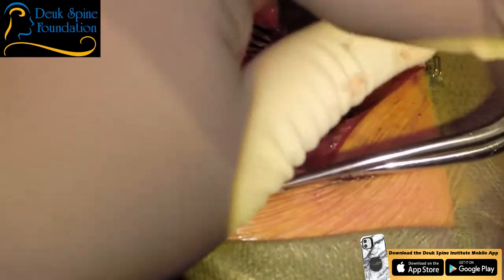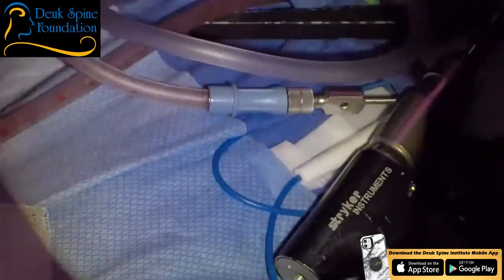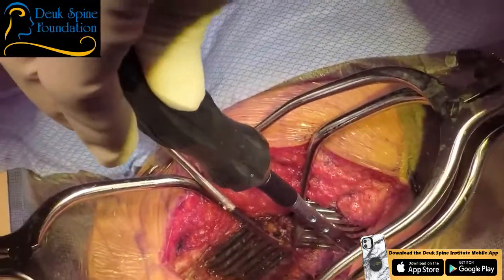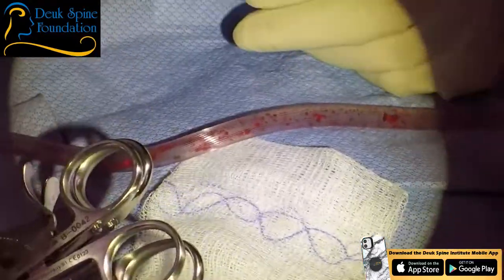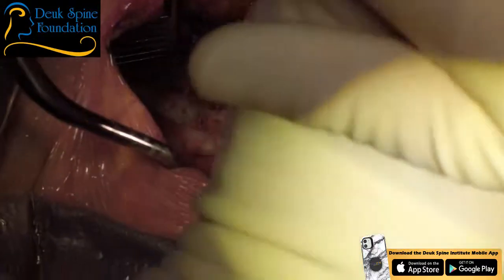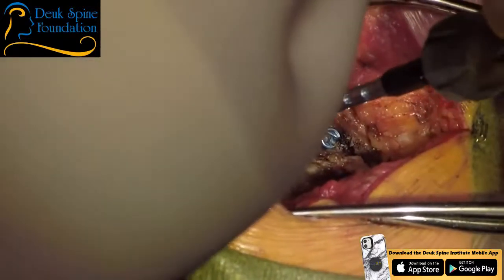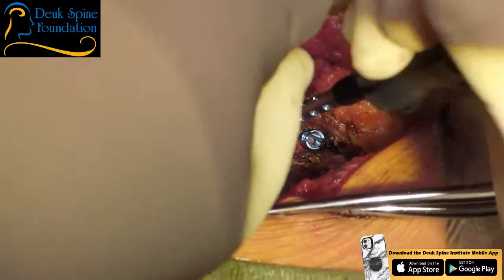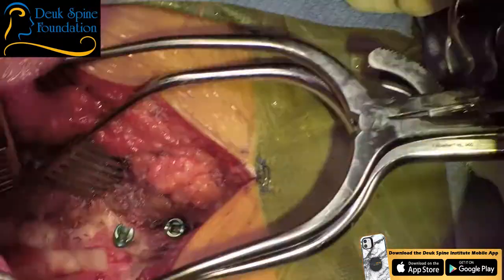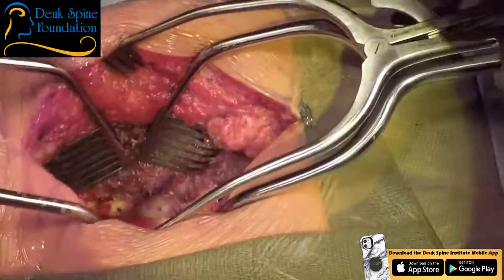Oh, that's tight. Really good purchase. You want to feel that purchase? Twist it. Purchase. That's some really nice tight purchase. You know, you're in the pedicle there. All right, you're just a couple millimeters inferior to the facet. Yeah. 14. Mm-hmm. That's where the pedicles are.